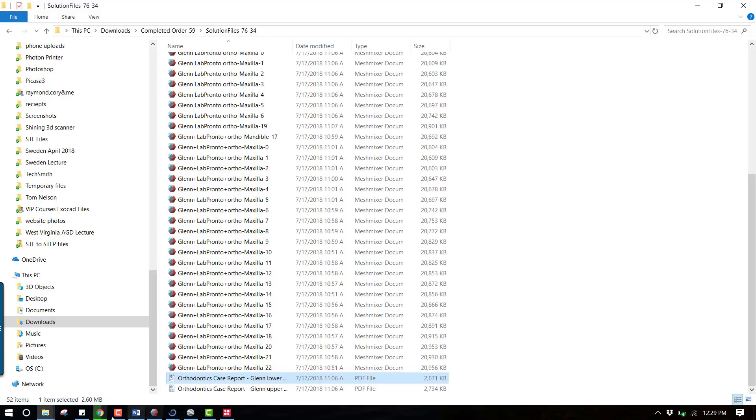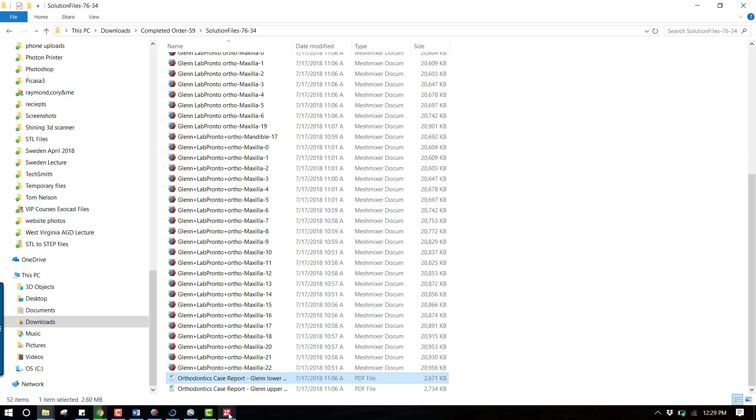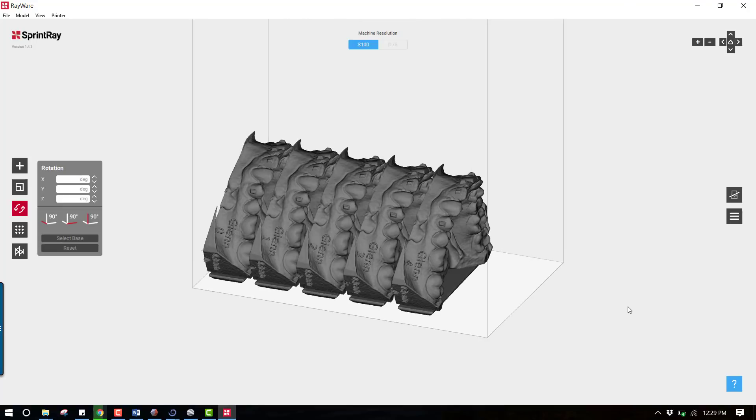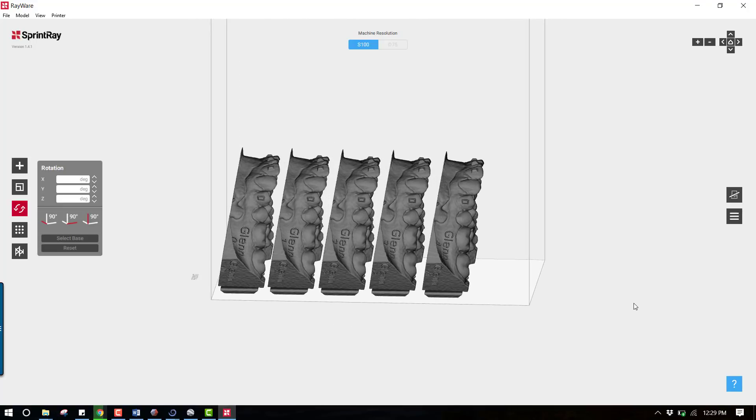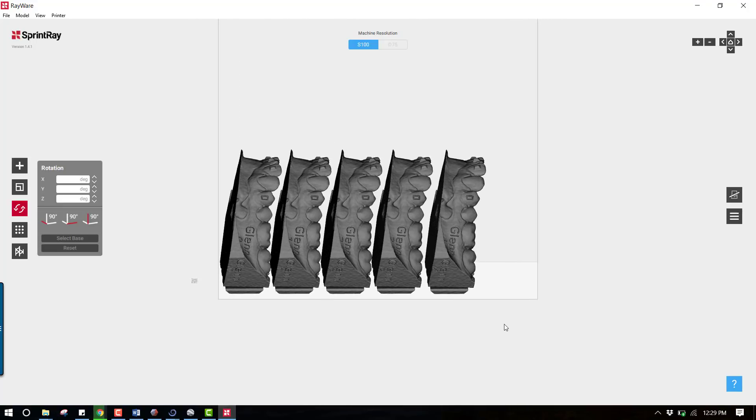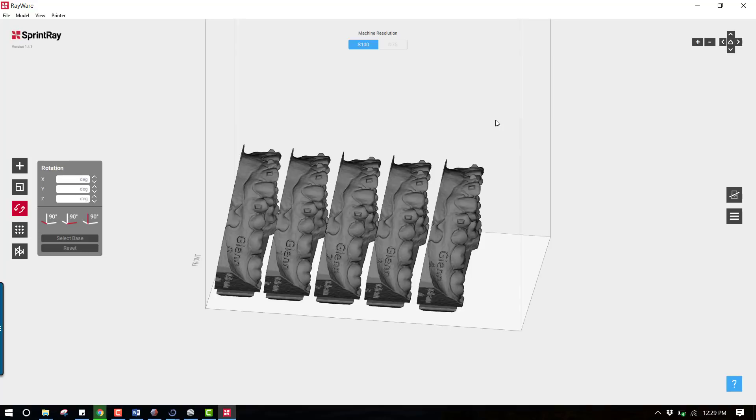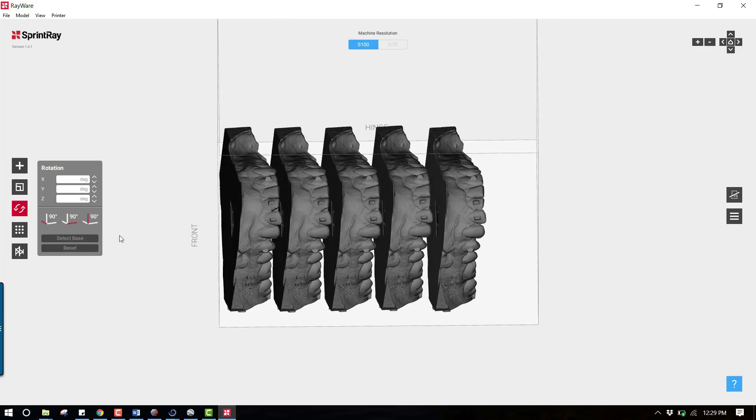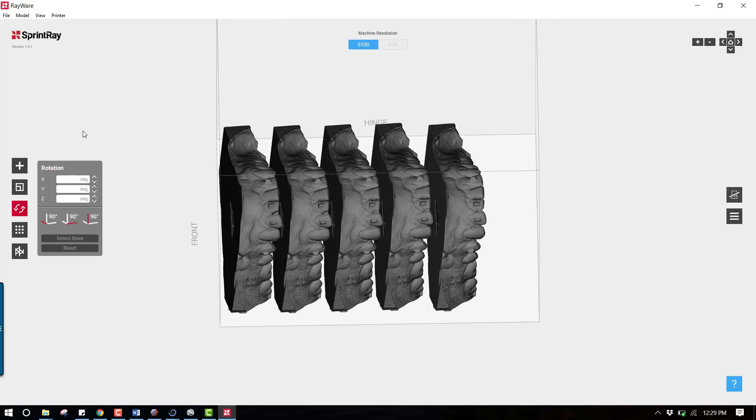So these models have now been submitted to me and we're ready now to go ahead and 3D print these. I'm using the Moon Ray printer from SprintRay - I found this to be the most easy to use and efficient printer that I've got, and I've got seven printers I think now, so this one's really my favorite.